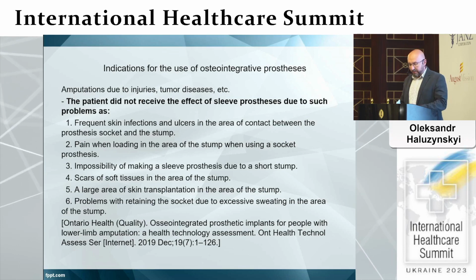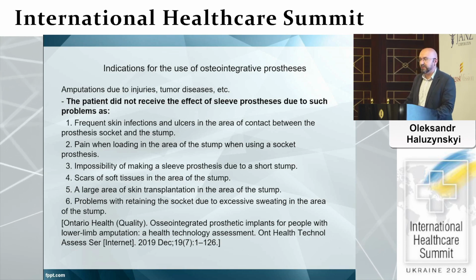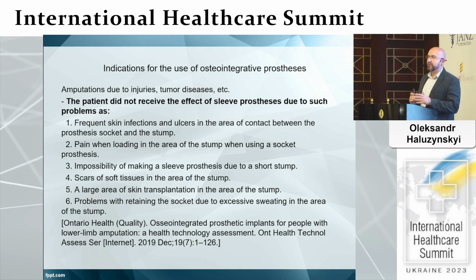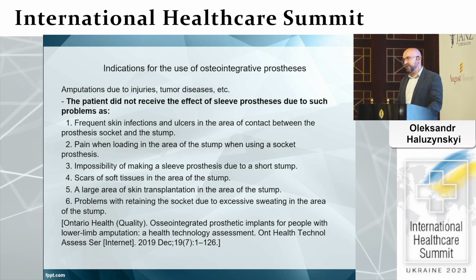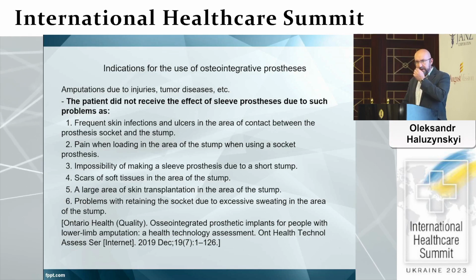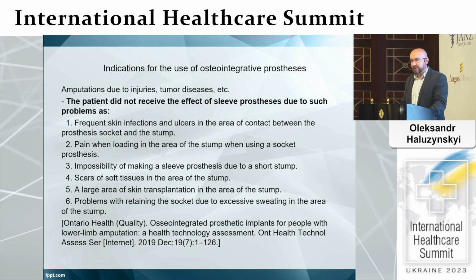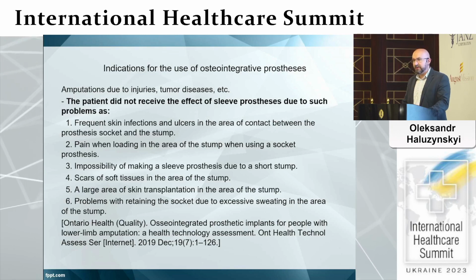With the above facts taken into consideration, let us also consider the advantages which outweigh those contraindications, to see what the direct indications will be. First of all, we have to understand this is not a magic rod. This is not a panacea. I do remember taking part in the Bologna event recently, where we discussed the advantages of osseointegrative prostheses, namely because some patients are not fit for regular prosthetic devices and solutions.